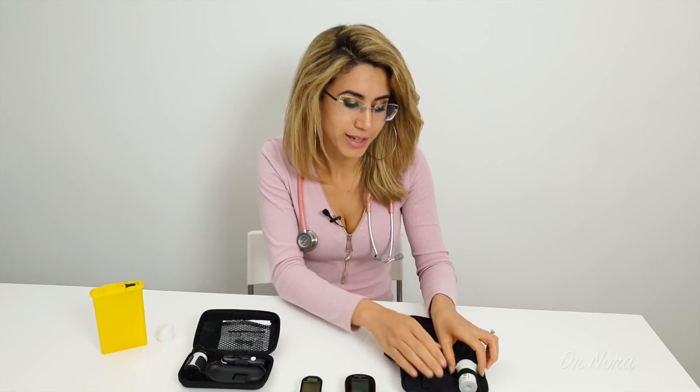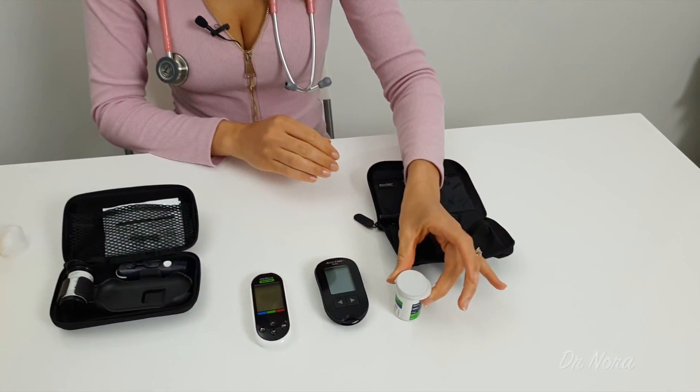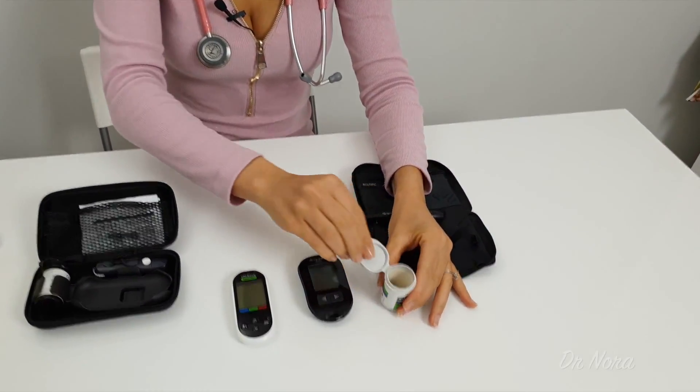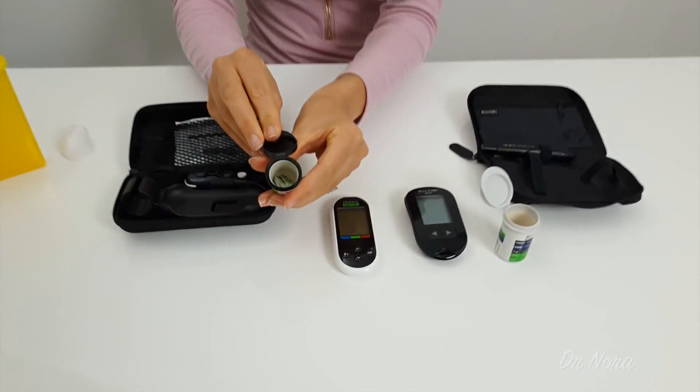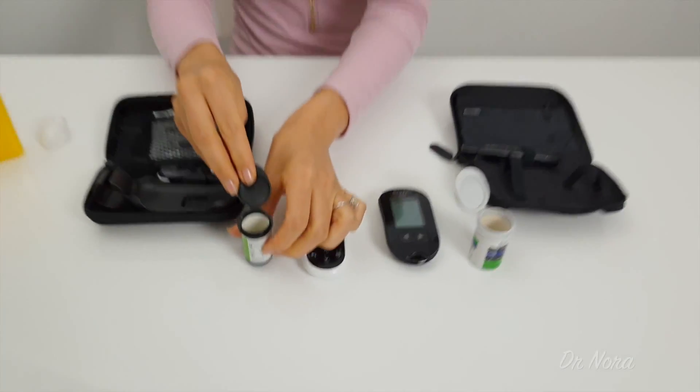Now speaking of testing strips, each of these glucose machines comes with their own specific testing strips. It is really important that you don't mix the testing strips with different machines because it won't work. So make sure that your prescription is correct before you insert it into your machine.